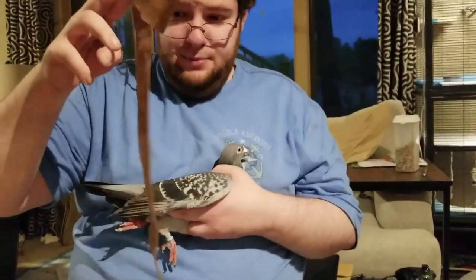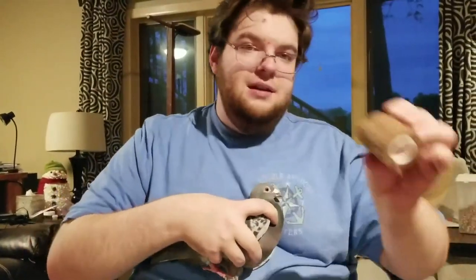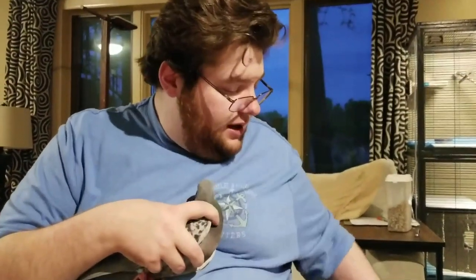So what you're going to need is vet tape. It usually comes in a roll just like this — this one's from some horse supply place. I've also got some medical tape: I've got MicroPore, which is real thin, and I also have a thicker, stickier one called DuraPore. I believe both are by 3M.